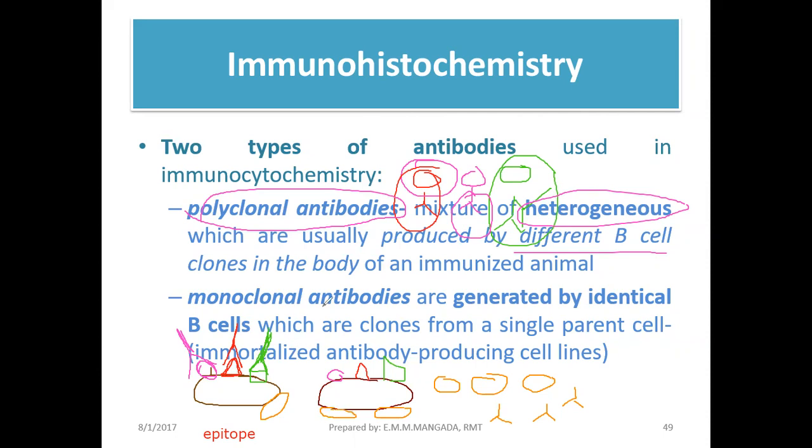So guys ha, tandaan ninyo, dito kanina, these antibodies here are your polyclonal antibodies. So they bind different types of epitope. Kung si pink, siya ay anti-pink. Hindi siya pwedeng maging anti-green. Nakukuha? Kasi pink siya. It's directed against the pink antigen. Guys, the colors I'm using here are just codes for you to understand the binding, or the relationship of these antibodies to their antigen. So these are your polyclonal antibodies.